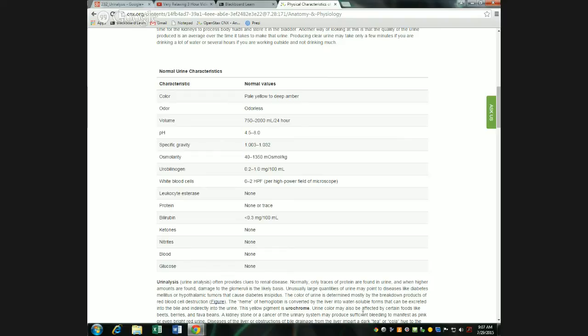I wouldn't say it's exactly odorless. Samples tend to have a little bit of smell, because when you smell urine, you can tell, and that depends on how much stuff is in there. I would say odorless is a bit of an understatement. But when there's an infection, that smell is different than the smell of just regular urine. There's going to be particular smells associated with things that might be in there.